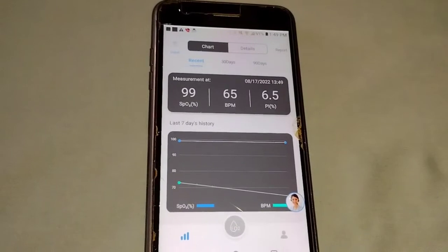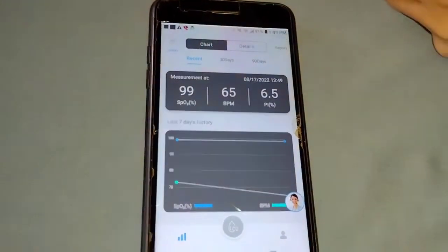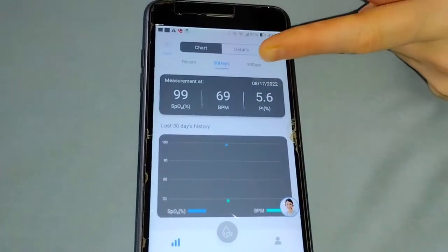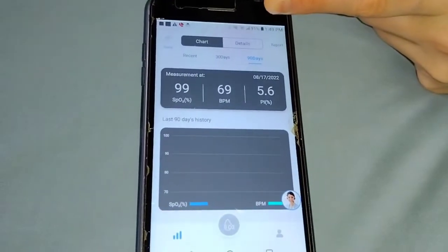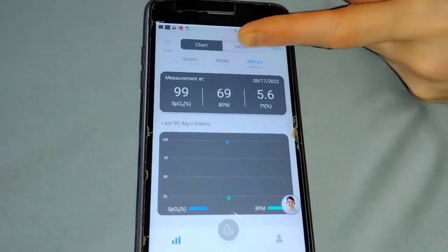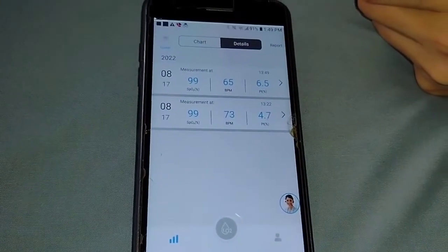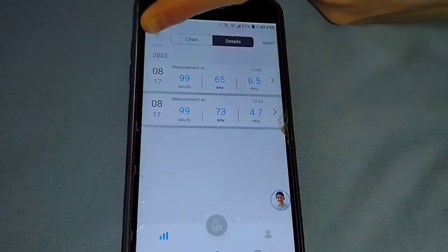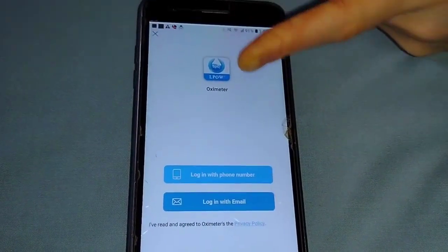You'll be able to go back and look at all the information you've saved — you can view it in chart form or in graph form. It also lists it by date and records everything your oximeter does: the blood oxygen saturation, your pulse rate, your perfusion index, and your pulse waveform.